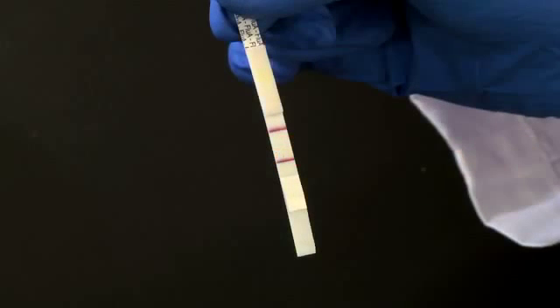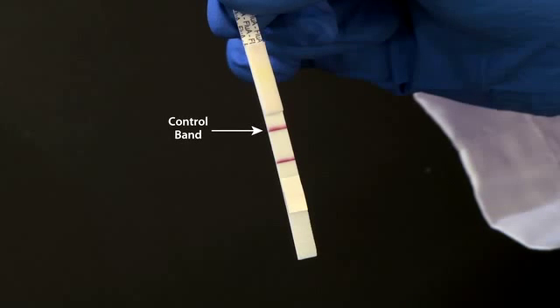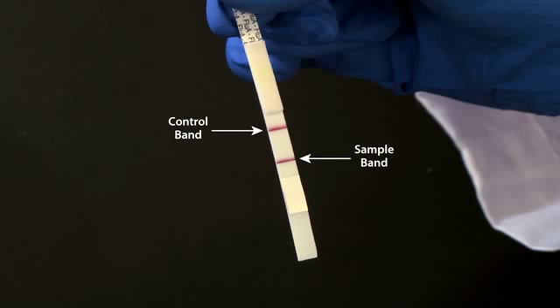After 15 minutes, examine the test strip for the presence or absence of pink-purple bands in the center of the test strip between the two absorption pads. The control band appears in the upper end of the test strip, closest to the handle, while the sample test results are read in the lower portion of the strip. After reading the results, discard the test strip in an appropriate biohazard container.